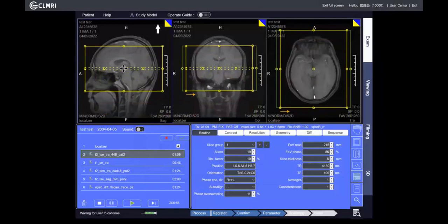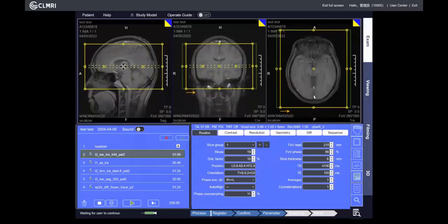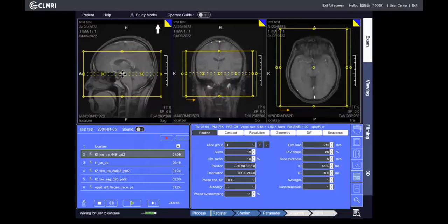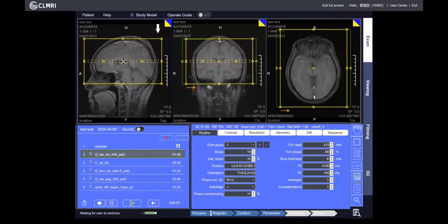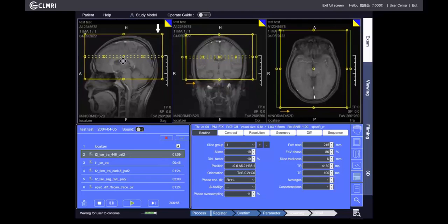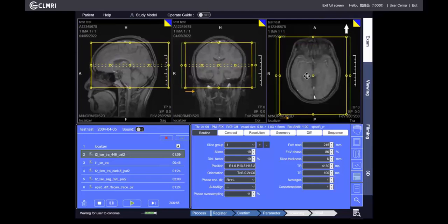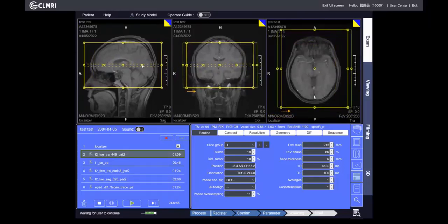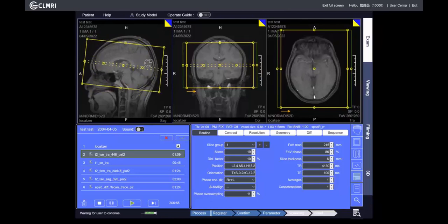By moving the slice group, you can see arrow indicators. The right arrow is the AI assistant giving you tips — it means you should move the slice group until the white arrow disappears. If the white arrow points down, that means your slice group is too high. The arrows can also indicate anterior, posterior, left, right, and rotation — clockwise or anti-clockwise — depending on the positioning range required.